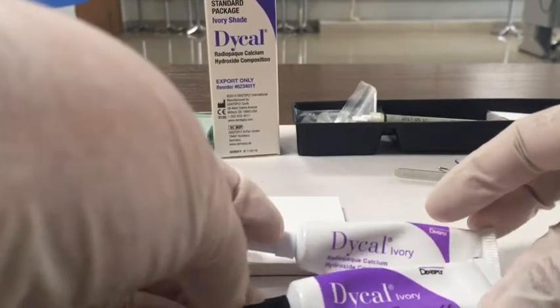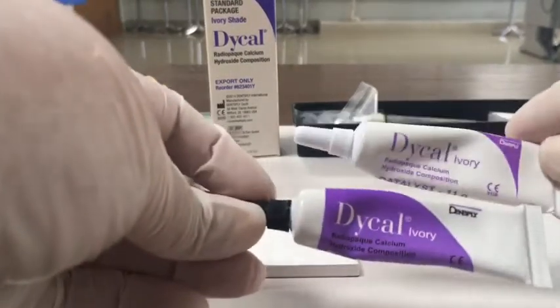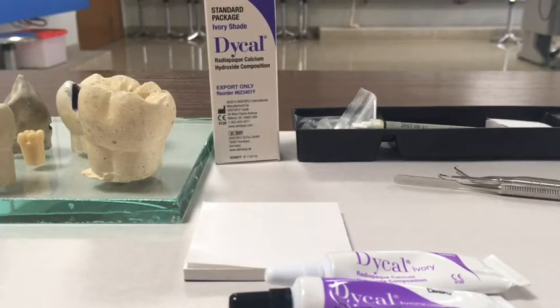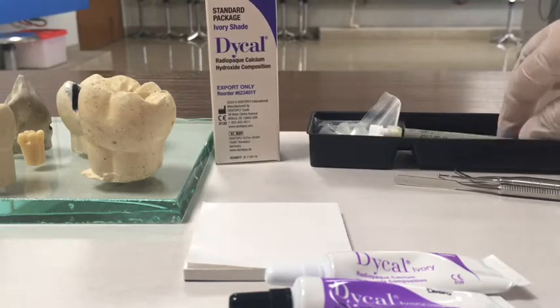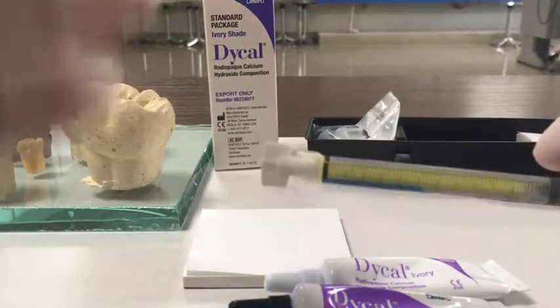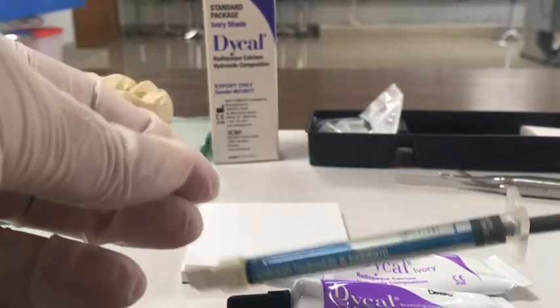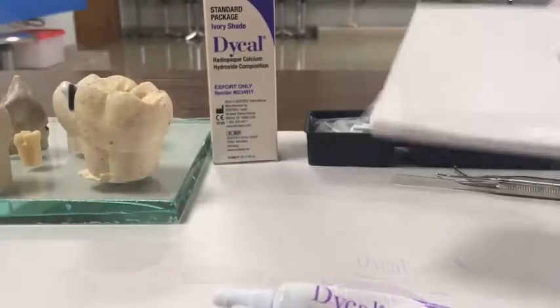But we have another type of calcium hydroxide which is used in endodontics, and this calcium hydroxide is the non-setting type, which means that it will not harden upon application. This calcium hydroxide is supplied in the form of a syringe, and it's a creamy paste-like material which is inserted into the canal system for disinfection purposes.